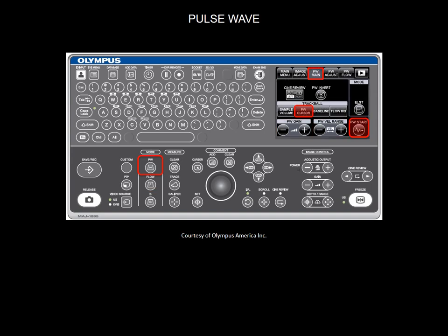Pushing the pulse wave Doppler button will again change the touch panel menu. Move the PW cursor on the area of interest using the trackball, then press the PW start button to start the pulse wave Doppler.